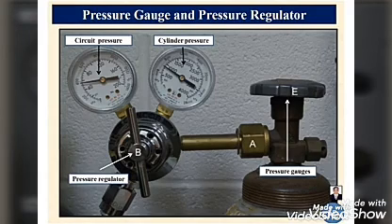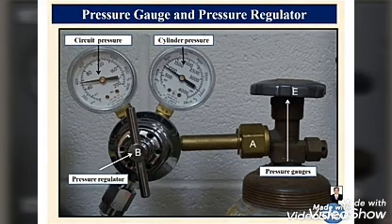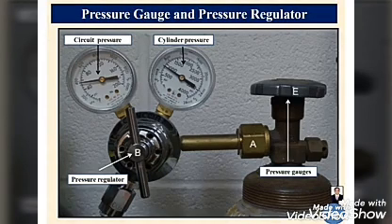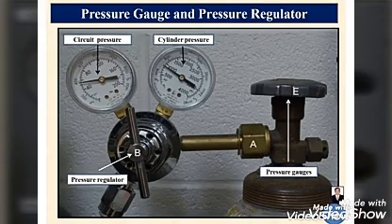In the next one, the dial is a pressure regulator dial, meaning the pressure reducing valve. It converts the high pressure into low pressure and allows oxygen to go toward the patient at only 40 to 50 psi. A full bottle has 2200 psi, so this is a high pressure system. Our animals, even human patients, even canine patients cannot tolerate these pressures. Our lungs and animals' lungs tolerate only 40 to 50 psi.